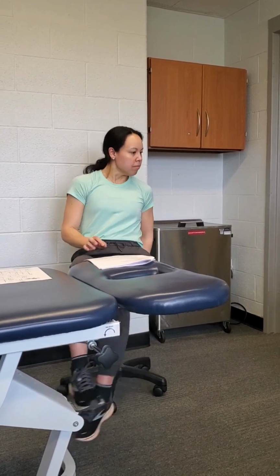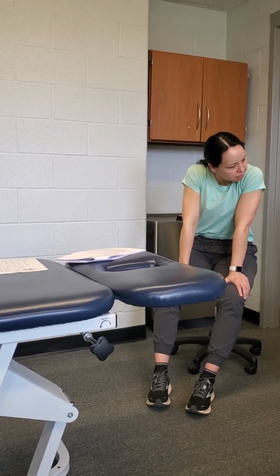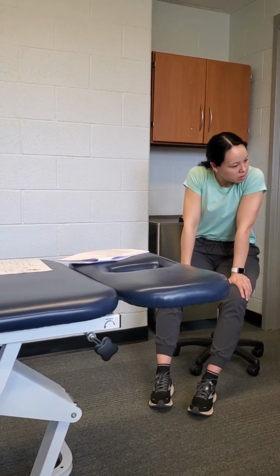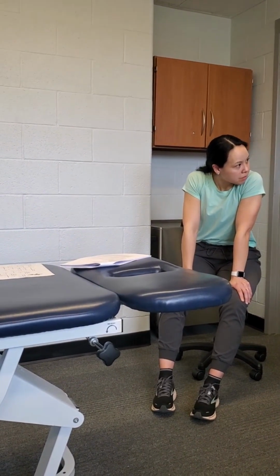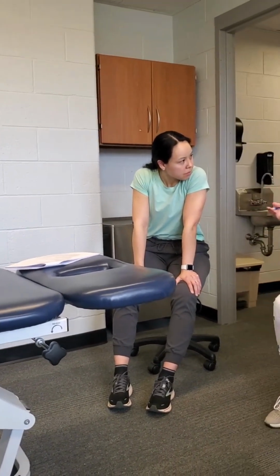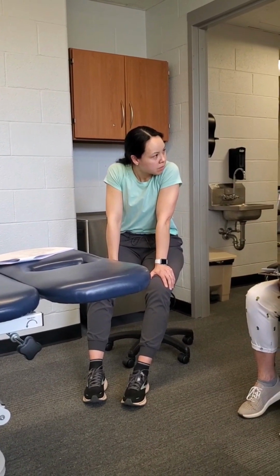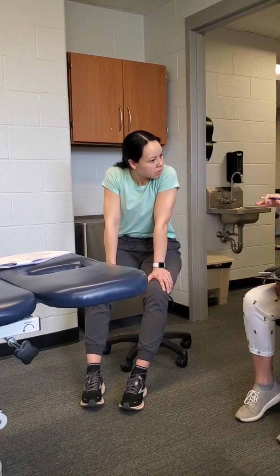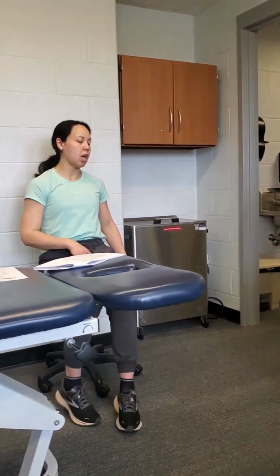Yeah, of course. With the 20 to 40% 1 rep max, I know you gave us the RPE scale to use as well. Are you finding, in the training you went to, that they're talking about really bringing people through a 1 rep max on the uninvolved side to help determine that, or what are they using to determine that?